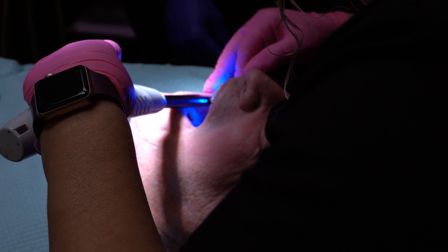With the patient that I had an opportunity to uncover, I was able to place the locators and take impressions for his denture. What I love about the class is not only are you placing implants, but you also get to see the restorative side.